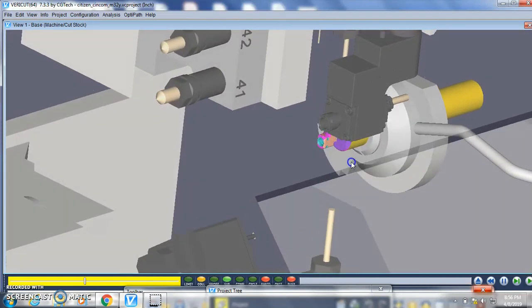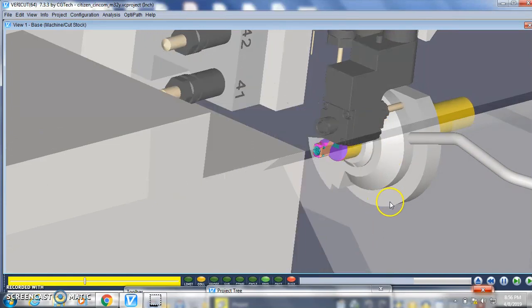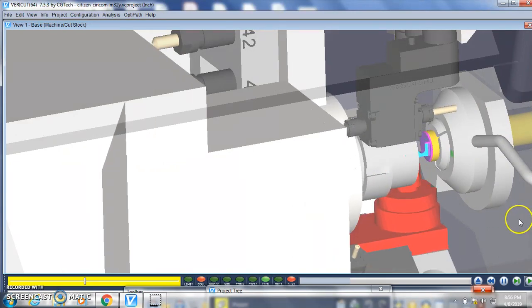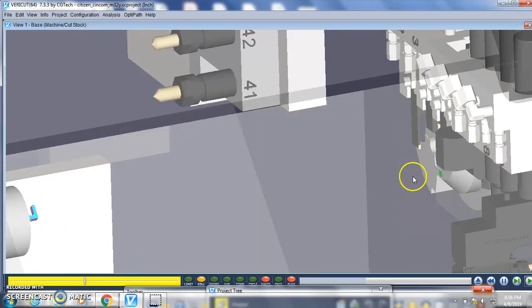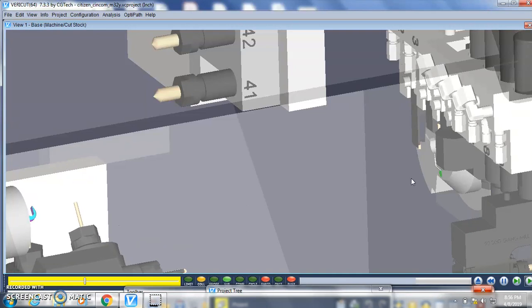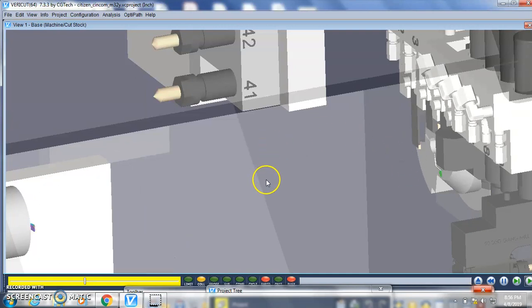In future videos, we'll see how to post the tool path. Right now you've seen the tool came and pulled the bar out. The sub-spindle is coming in, holding on to the stock. Basically, right now in this operation, the transfer is happening between the main and sub-spindle. The sub-spindle came and held the bar from the main spindle, thereby giving a more robust clamping for doing that side milling.